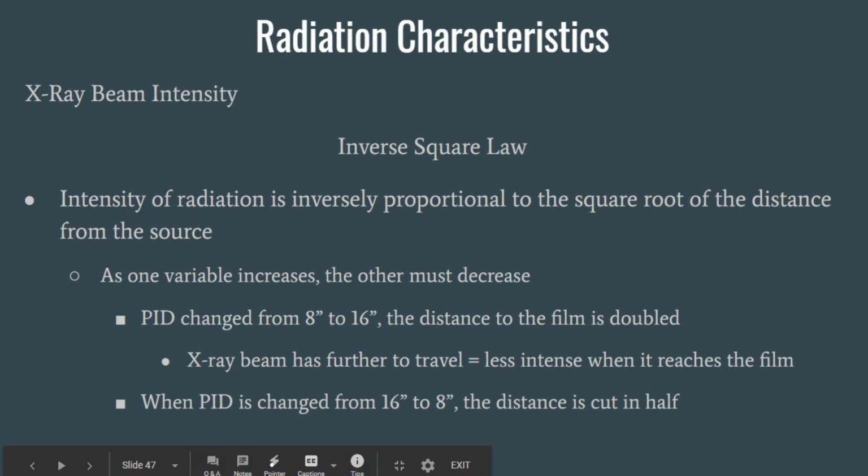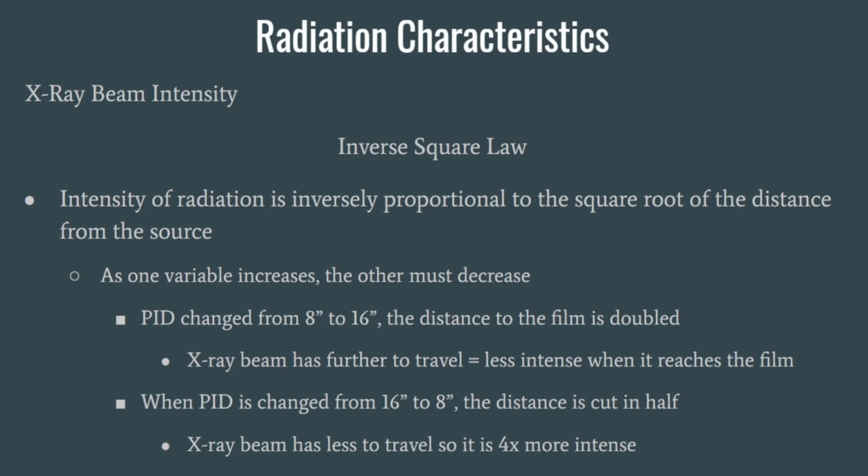And if we were to flip that, when the PID is changed from a 16-inch to an 8-inch, the distance is cut in half. So it has less distance to go. So it is 4 times more intense.